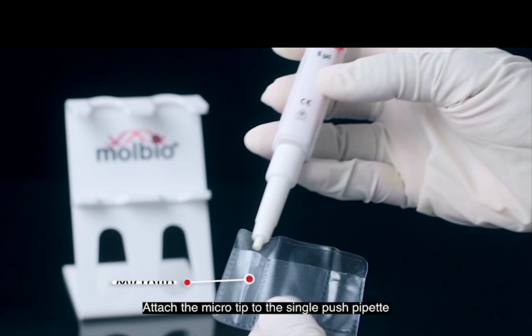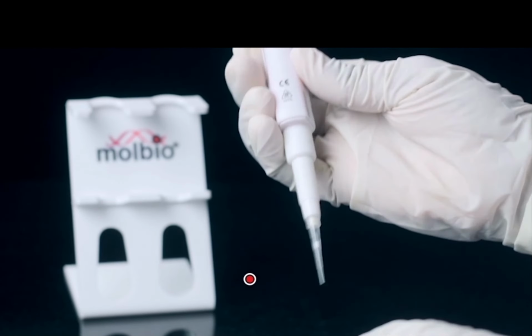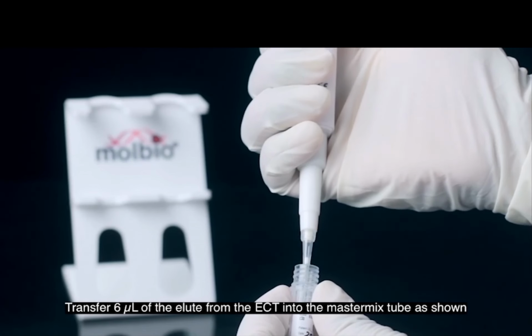Only one tip is there for one test, so it will get wasted. So you have to hold the particular tip with the other hand, and only then place it. Don't just press it against the envelope. So you have to be careful when you use the tip. Then press it fully.